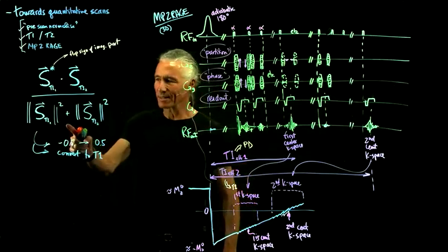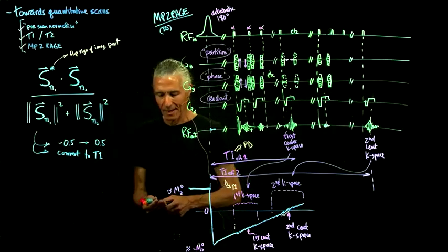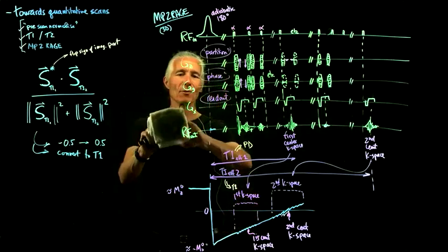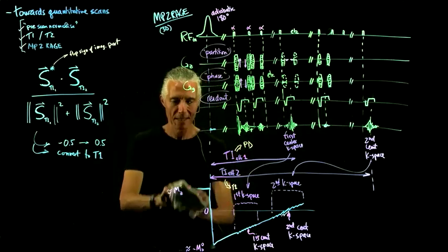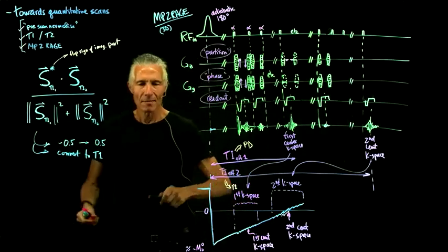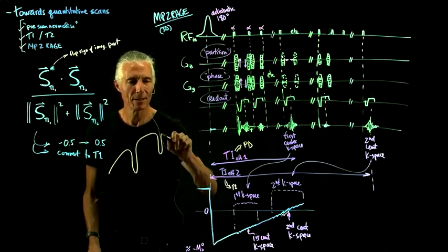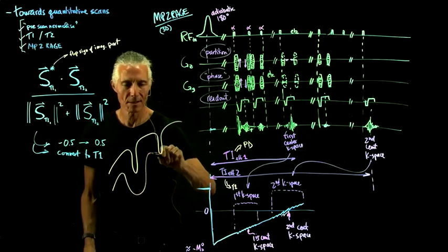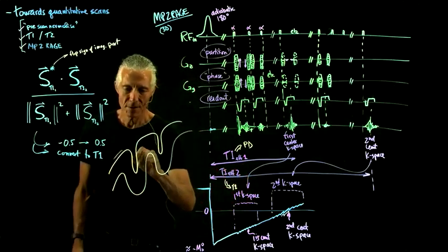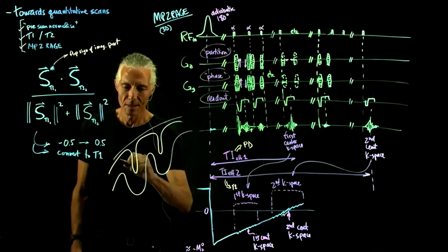So say we do this thing. One of the problems with this is that if we look at the cortex, so here's the cortex here, the cortex looks really good. Gray matter and the white matter look really good. And the dura is pretty good. And then we get up to the skull.